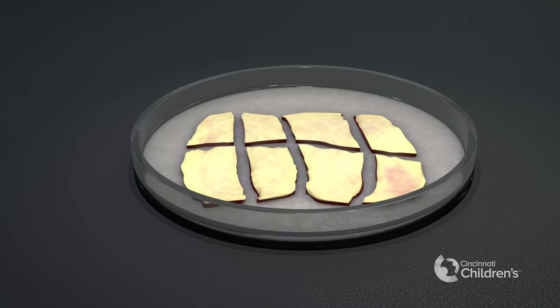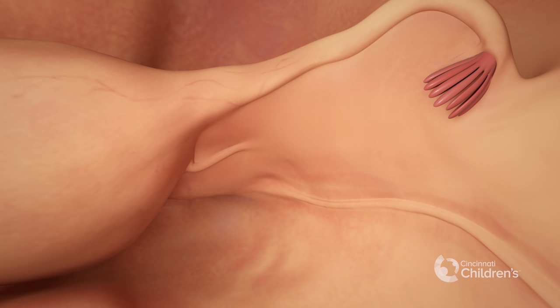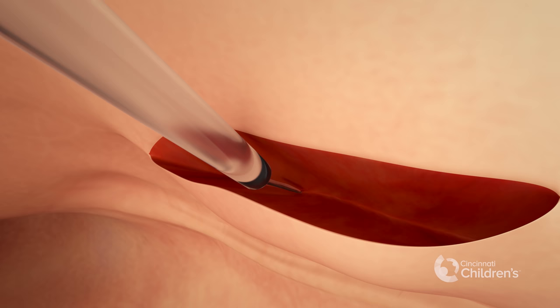When the patient is ready to attempt pregnancy in the future, the small ovarian tissue strips are thawed and placed back into the pelvis by laparoscopy. In this first technique, scissors are used to make a two to three centimeter incision in the peritoneum or lining of the abdomen. The thawed ovarian tissue strips are then placed into the space and sealed.